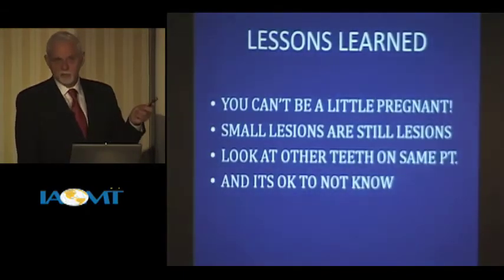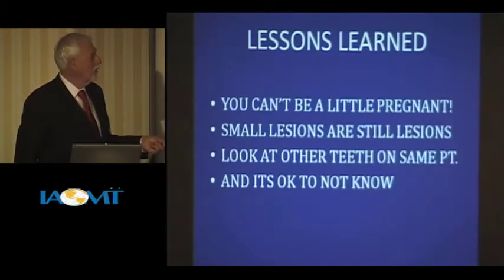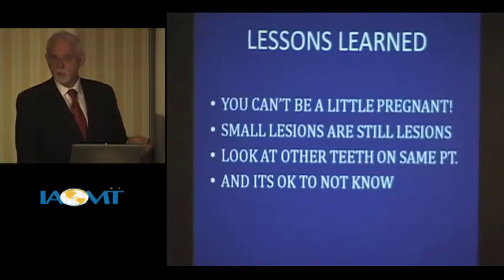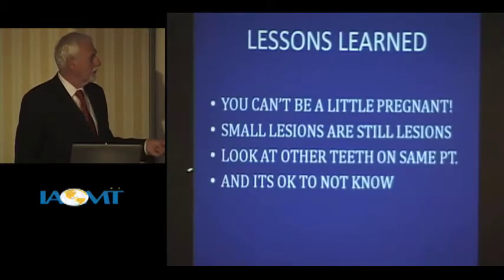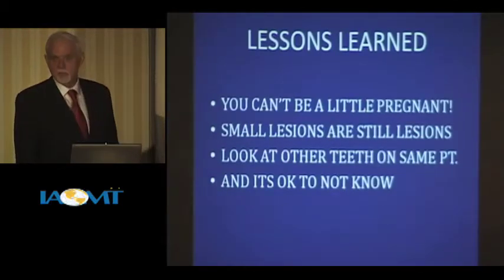Lessons learned. You can't be a little pregnant. It's either an infection and an abscess to me or it's not. Small lesions are still lesions. Sometimes that's easier said than done. So, you know, look at the other teeth on the same patient in your CAT scan, and sometimes it's okay to just not know.